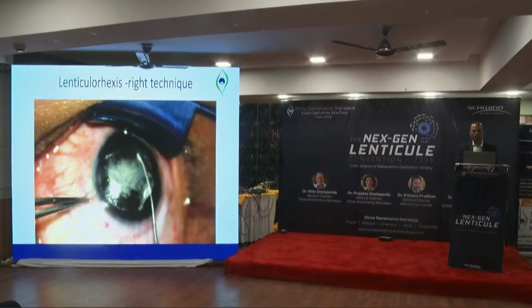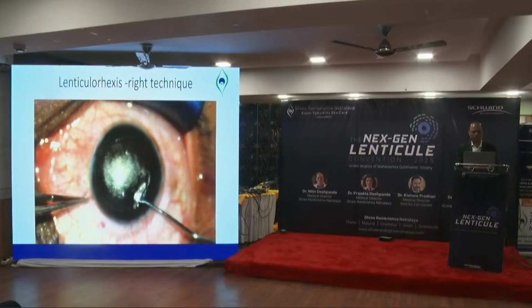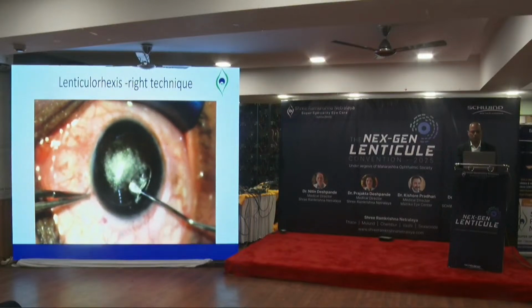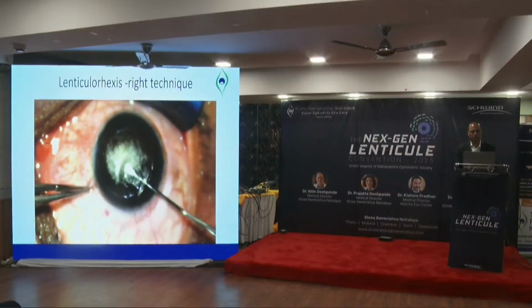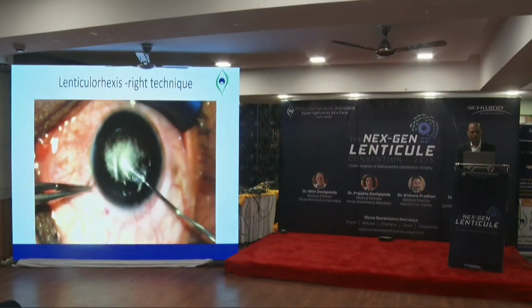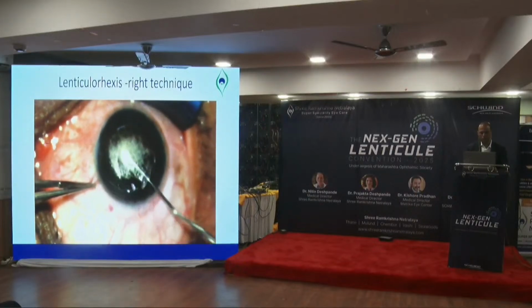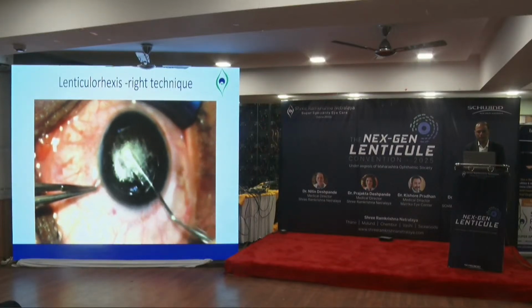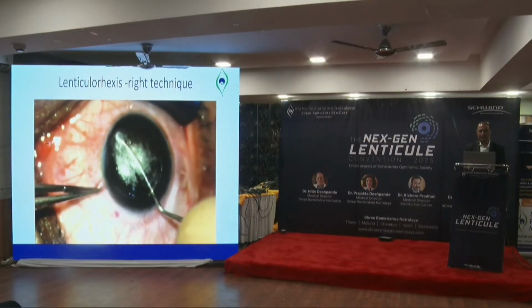It's better to do the least maneuver in the center, because every time you go to the center, you are causing some. Then posterior, you are feeling the resistance there, you know you are in the right place. I'm not able to forward here, so we'll just bear with this. You dissect, dissect, dissect.